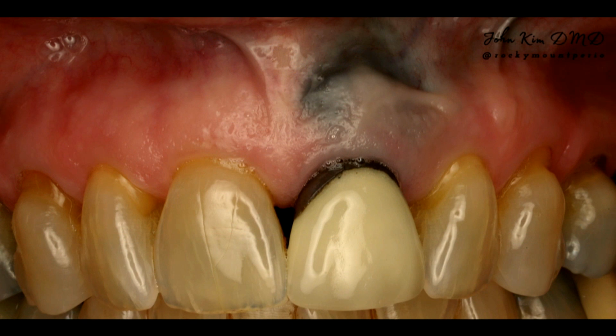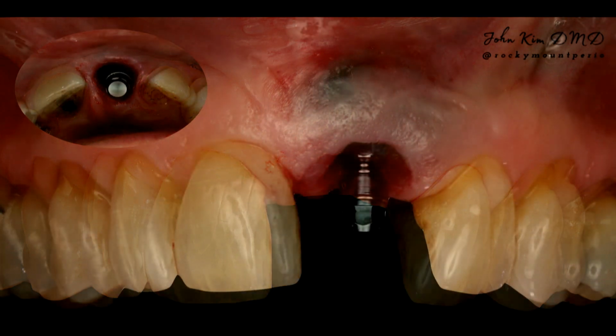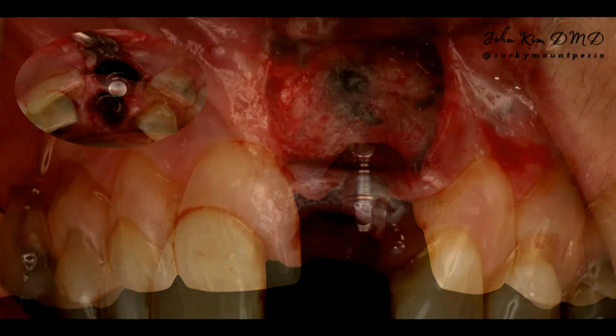Yes, and not every case is straightforward. This is a patient that has had multiple surgeries, referred from Chapel Hill, and we're going to attempt an immediate implant. You can see there's a lot of scarring. You can see a lot of residual materials left behind, just looking at the gingiva. So like I always emphasize, we try to do this in a flapless manner. Tooth came out very easily, but as I was palpating the facial, I could feel that we had a fenestration lesion, and got my implant in place.